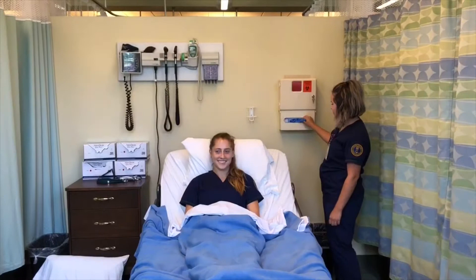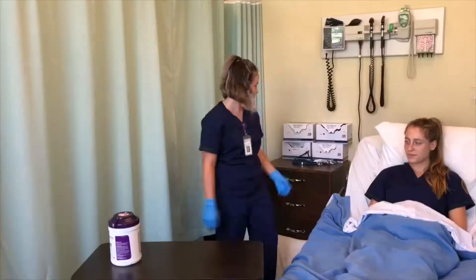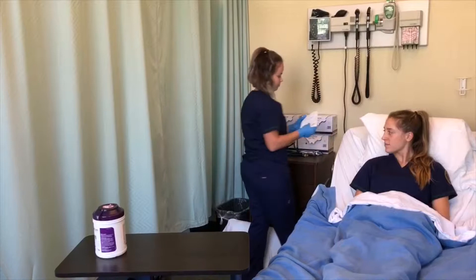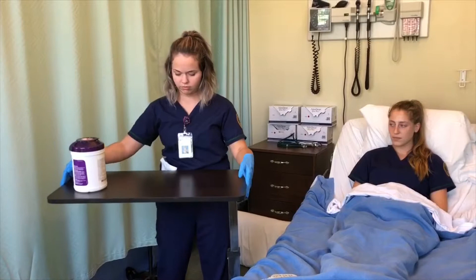Before she performs sterile technique, she's going to put on some regular gloves just to get ready. Before going to her table, she's going to gather more than one sterile glove package, just in case she makes a mistake. She has also gathered all her supplies needed for the Foley catheter, and now she is going to lift the table to an appropriate height and wipe it off with the sanitizing cloth.